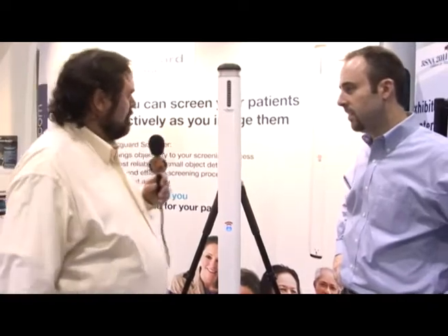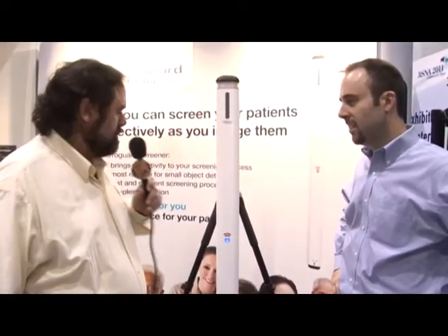Craig, this unit looks a little bit different than the one we talked about by the door. What can you tell me about it? This is a new product that Metrosense has put together and it's something that is to be used with patient screening rather than the entryway control. It's the same flux technology, which is top of the line, but packaged in a different way to handle a different set of problems.